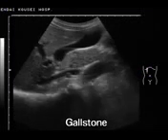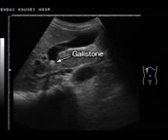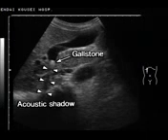This is a case of gallstones. A gallstone about 4 millimeters across is seen at the cervix of a gallbladder. A gallstone reflects much ultrasound, presenting a white image. A dark, no-echo area appears behind a gallstone. This area is called an acoustic shadow, which is helpful for diagnosis of a gallstone.